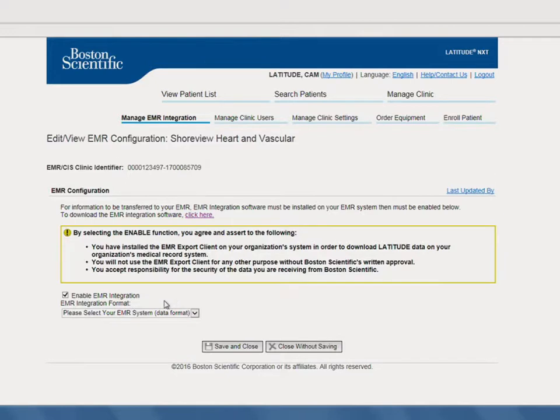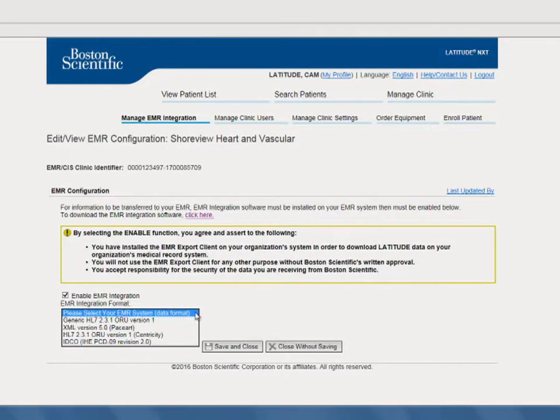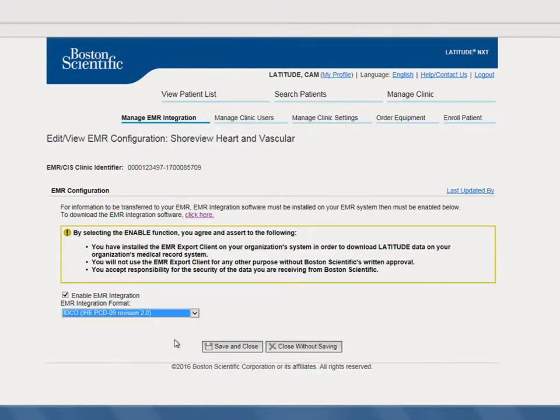At this time, you should also select your desired EMR integration format. Latitude Next exports data using a variety of data formats. Select the format that works best for your clinic and your specific EMR. Be sure to click Save and Close to complete the process.